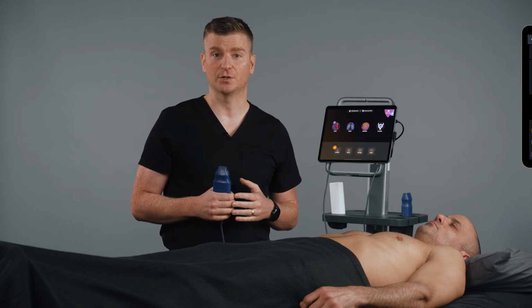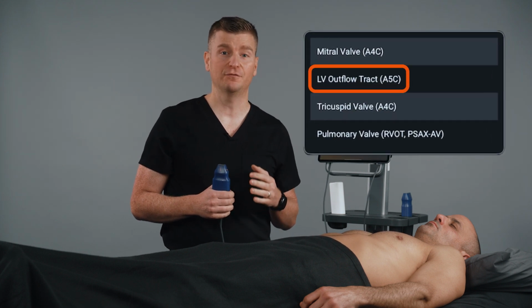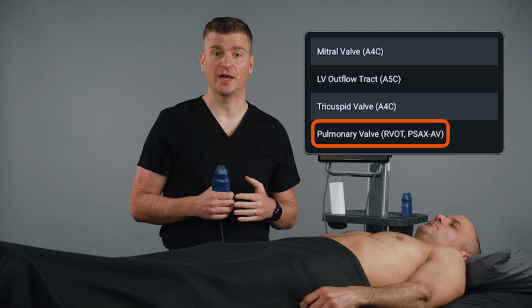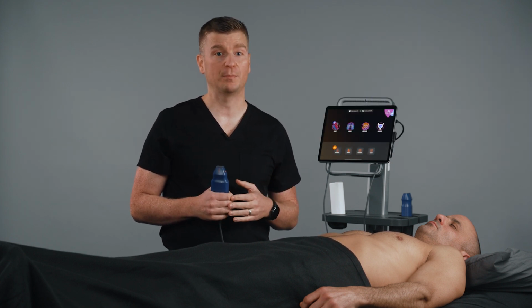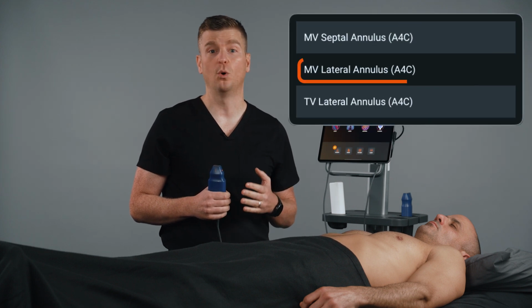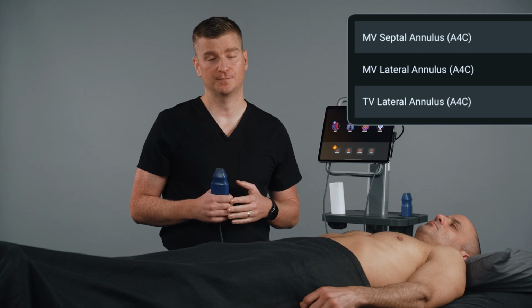For pulse wave Doppler, Auto Doppler can be directed to place the sample gates at the left ventricular outflow tract, the mitral valve, pulmonary valve, and tricuspid valve. For TDI, Auto Doppler can be directed to place the sample gate at the mitral valve septal or lateral annulus, as well as the tricuspid valve annulus.